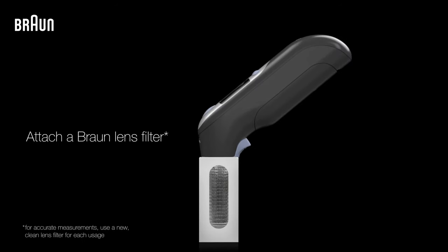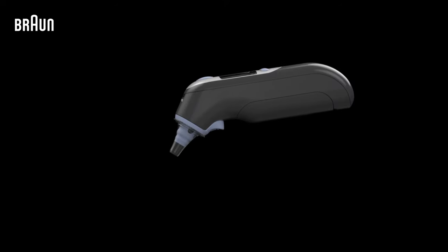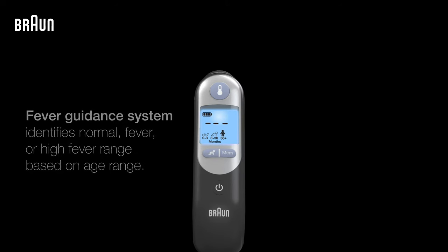Next, attach a lens filter to your thermometer by pushing the probe directly into the lens filter box and then removing it. Then select the appropriate age range by pressing the Age Precision button, which will help inform the thermometer's fever guidance system.